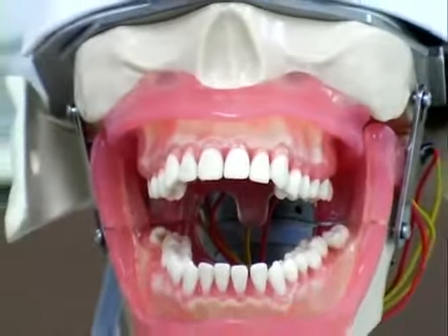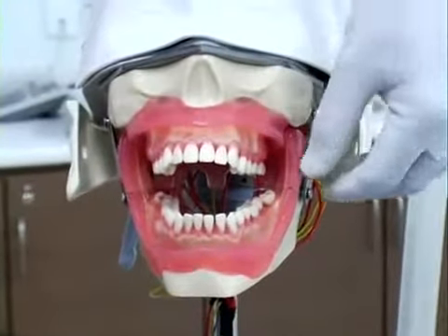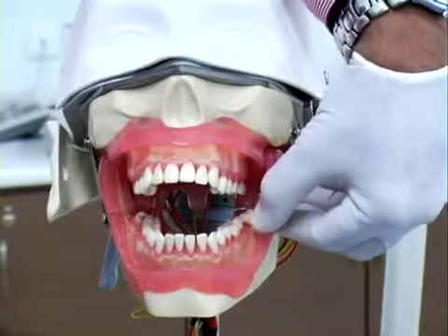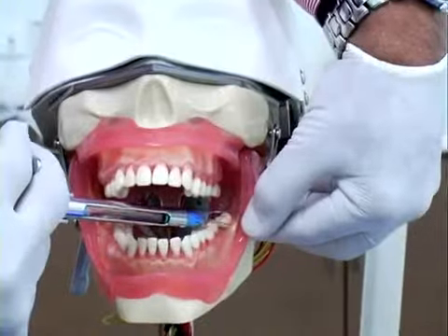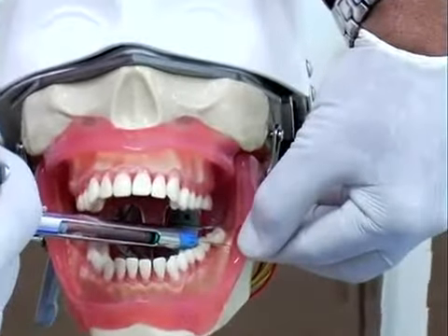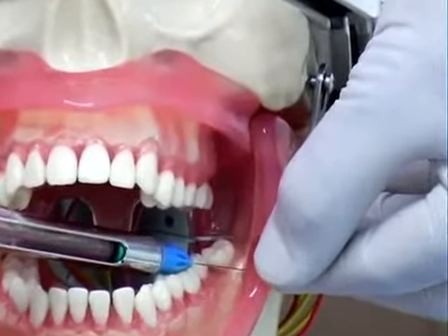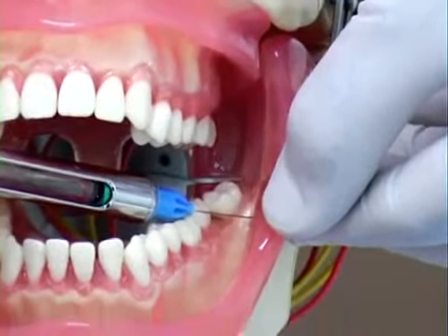For giving the long buccal nerve block, you have to infiltrate on the buccal side of the mandible surrounding the lower wisdom tooth area over here. You don't have to go that deep if you are blocking the mandibular long buccal nerve.